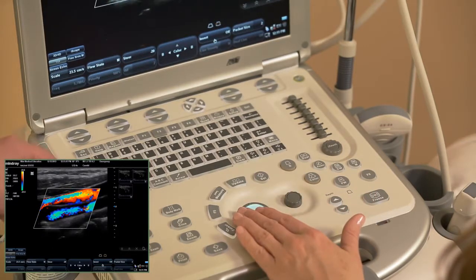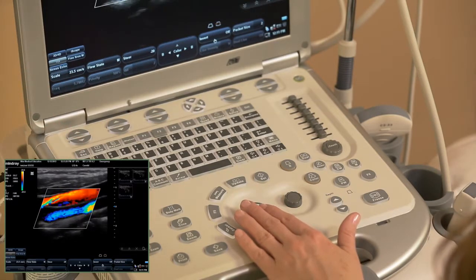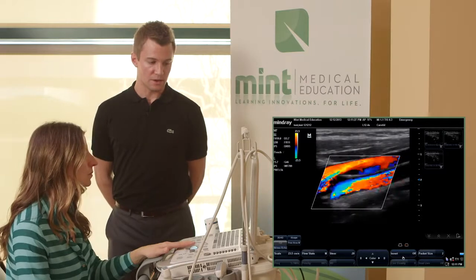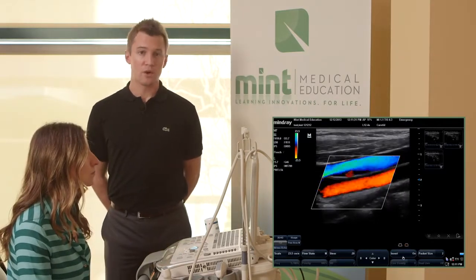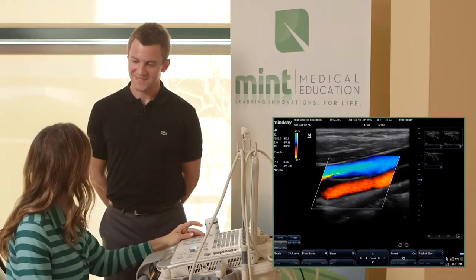And you'll see, there's other rows of those soft keys and things that you can change. And by all means, I think it's good that any user that feels comfortable playing with it can see that it'll change the image a little bit here and there. And again, knowing that you're not going to hurt the machine or hurt the settings. And if I go crazy with my settings, can I just go back to my presets? You got it. Yeah, exactly.